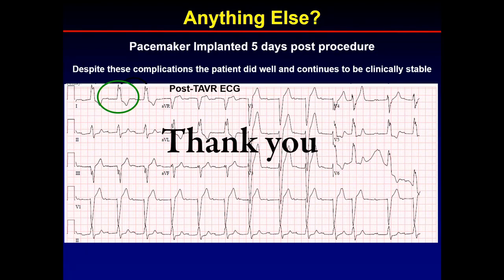The other thing is that in India we have a lot of people with vegetations pre-TAVR on the aortic valve. So is everybody actually putting filters into the carotids? In this patient, we put filters into the carotids, but the patient actually ended up embolizing into the iliac vessels. It's an interesting situation we face. Yeah, maybe we could ask Professor Waxman, Ron.